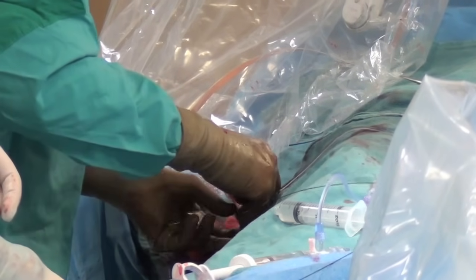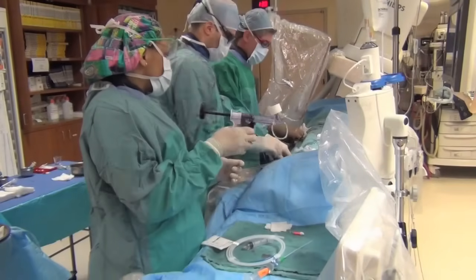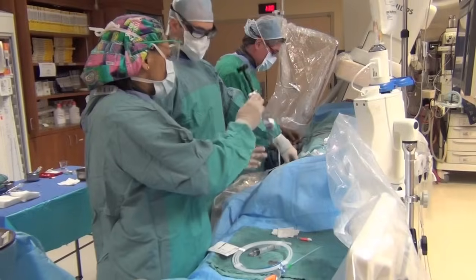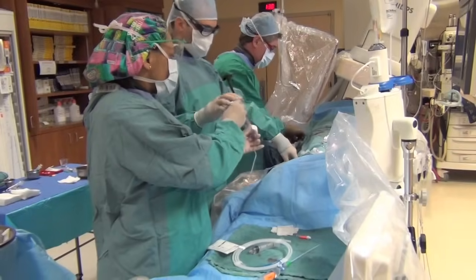Various treatments include medications alone, sometimes bypass surgery, and sometimes the balloon procedure with the stent, which we call angioplasty, or these days we call it PCI.